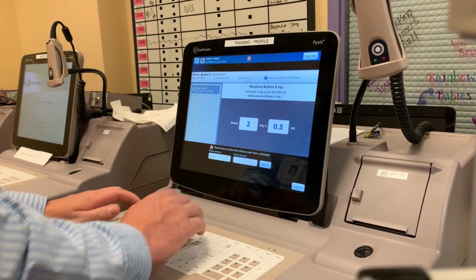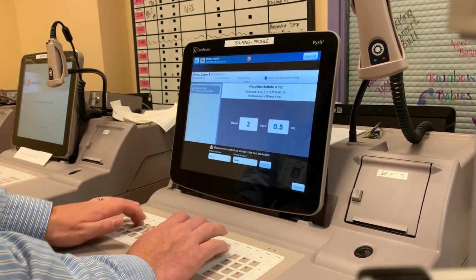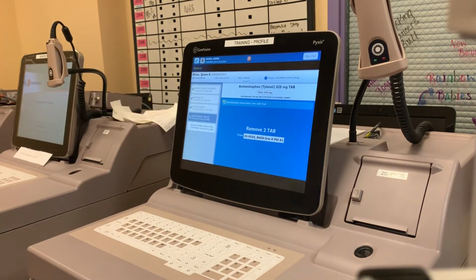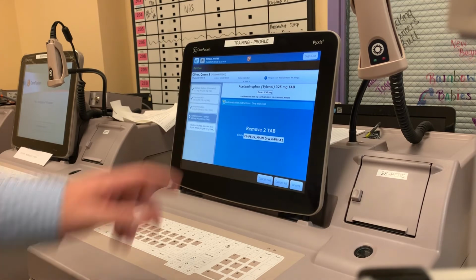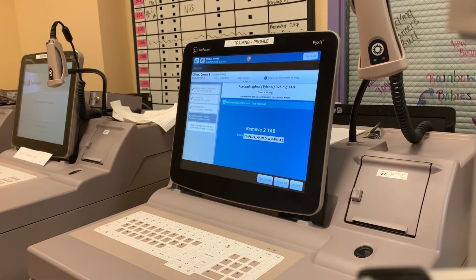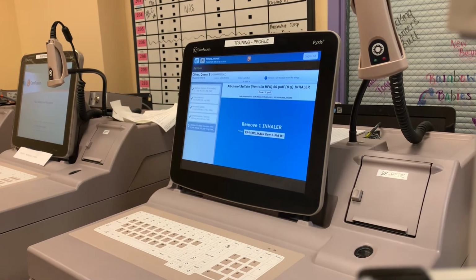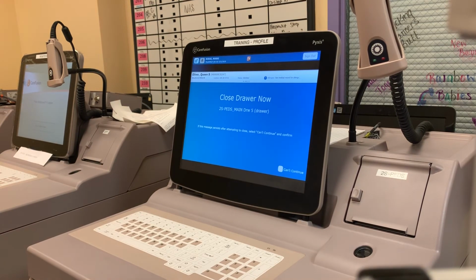They put their stuff in. They'll have their fingerprint, but I have their fingerprint and test here. And we're happy, and we're moving on. So now we're on Tylenol. Look, we have some administration instructions, give with food for some reason here. So we're gonna do what it tells us to do. Put our tab. And lastly, albuterol. And we have it.